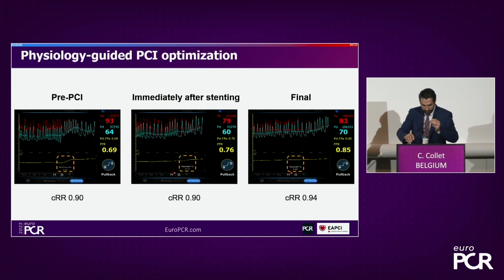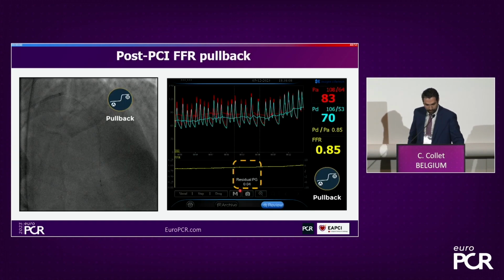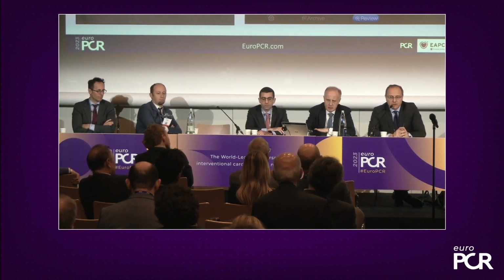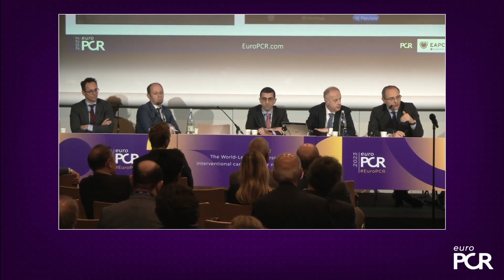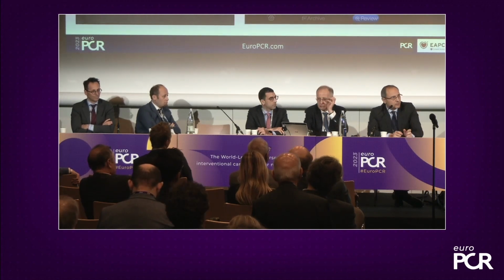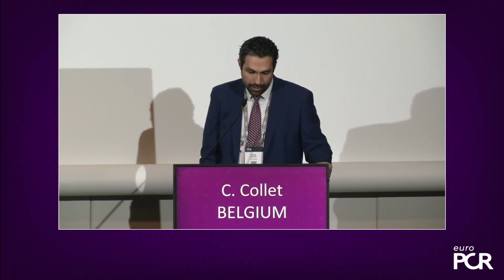Hold on the previous slide, because it's an important point there. The reason why you decided to stop at this point your revascularization, is it because your FFR went from below 0.8 to above 0.8, or is it because of the shape of the pullback curve? I think both elements play a role, Emanuele, but I think that what the pullback is answering is, what else can we do? And where? Where is the residual focal pressure gradient? Can we post-dilate more? Can we put another stent? And this is how we see these two metrics complementing each other.